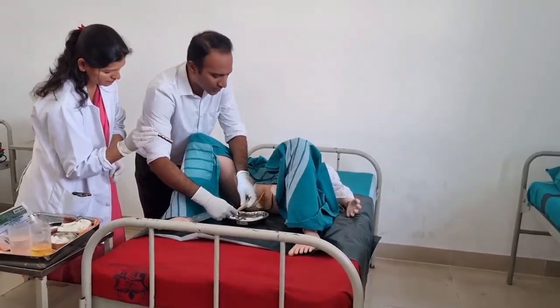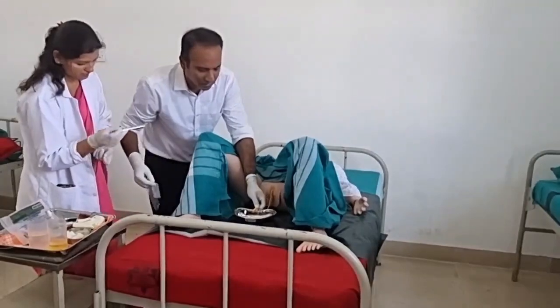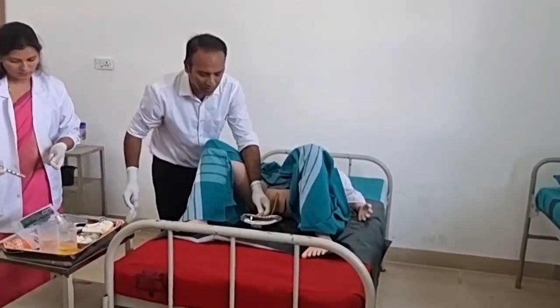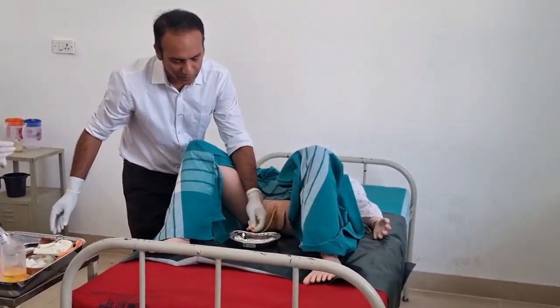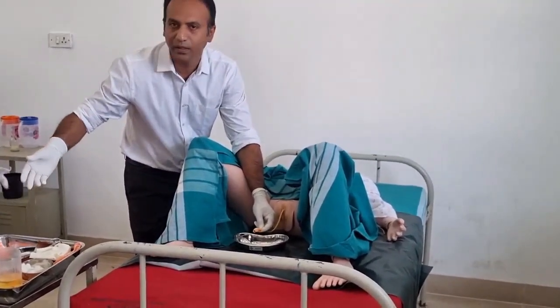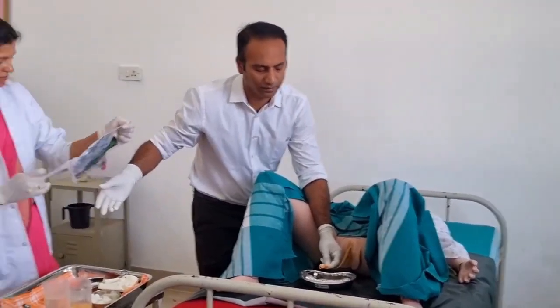Assume that it is a patient with a filled bladder. So immediately the urine starts flowing here. So I am just pinching it and we will connect the urobag, the urine collecting bag.